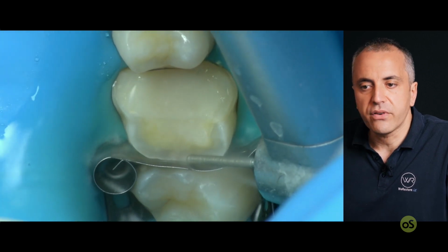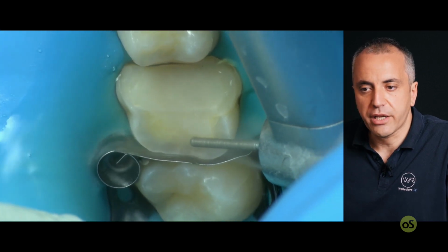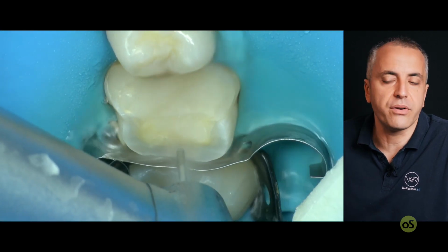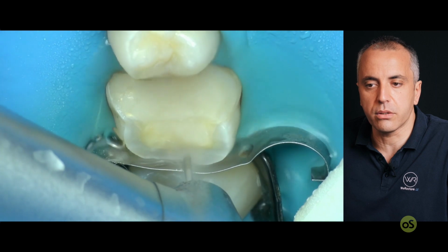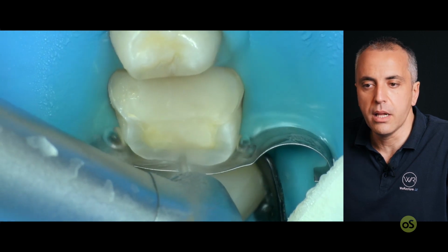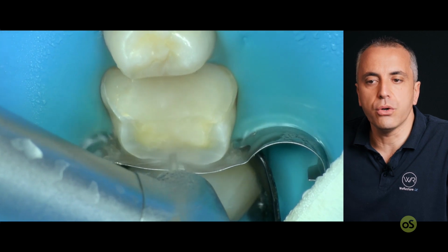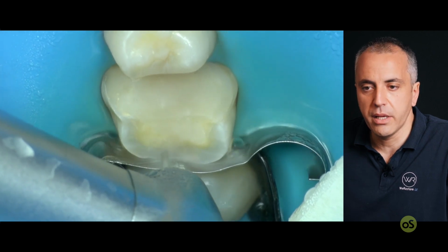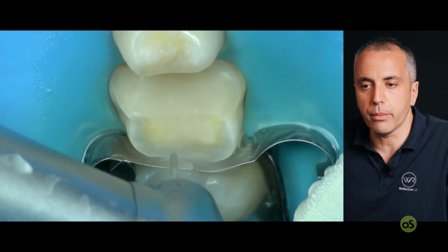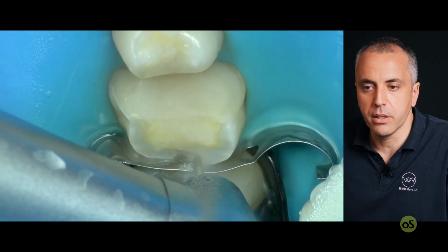As I said, me and Salvatore love this kind of protection very much. This is quite tough. You can also use a simple matrix, but this is very nice. It's called the interguard. In this case, we are preparing the slot. We start slowly with the low diameter, and we move from buccal to palatal in order to prepare this box.